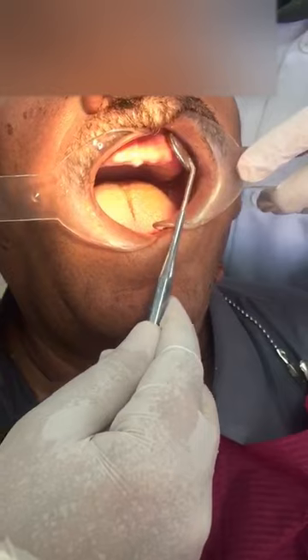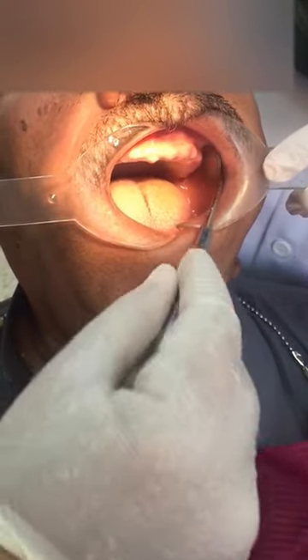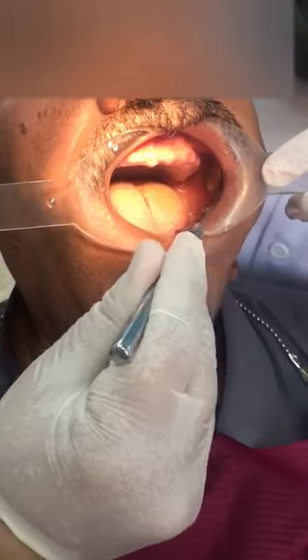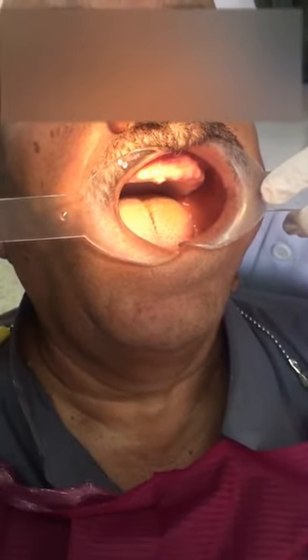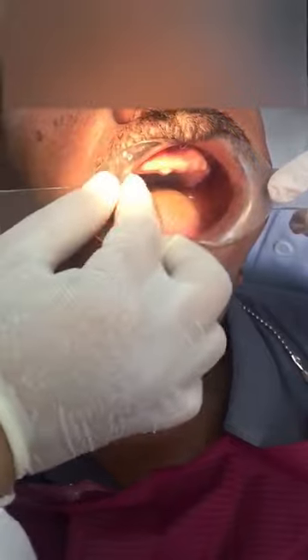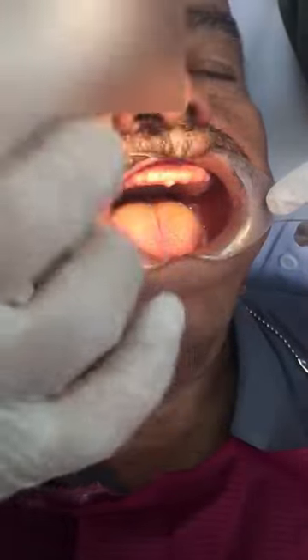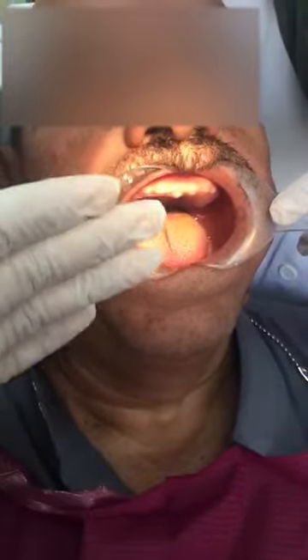This patient has it here, and also here on the canine eminence area, extending to the maxilla up to the molars. Now my question would be: if I have all of these undercuts in a position where I could withdraw the impression laterally rather than take it down — yes, he has severe undercuts and it will be difficult to take the impression down after it solidifies.